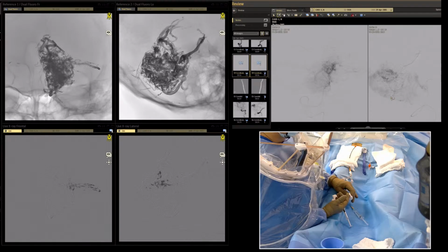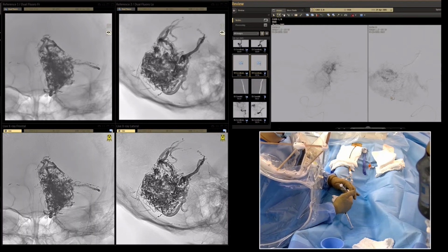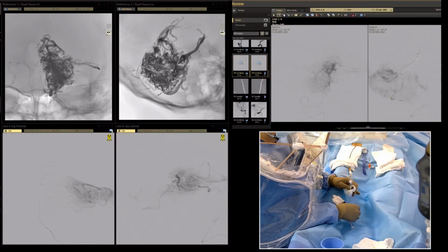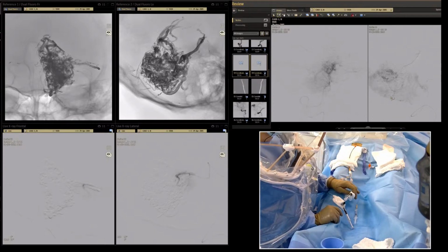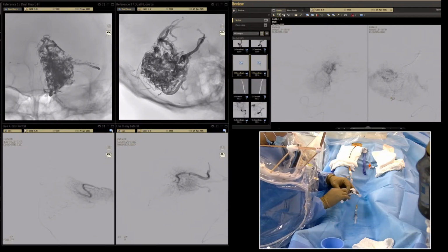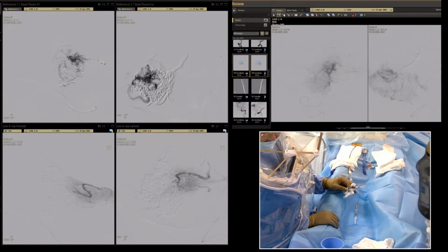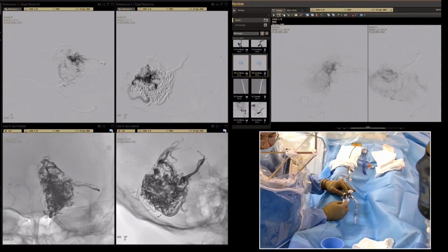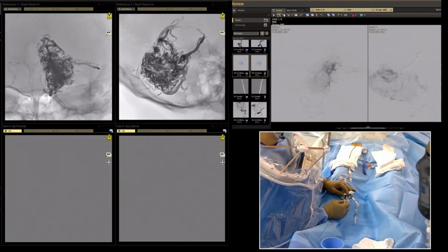Going to the territory with the AVM. This is the so-called eagle grip technique, thanks to Fabian. Fabian called it the Kazakh eagle grip technique.